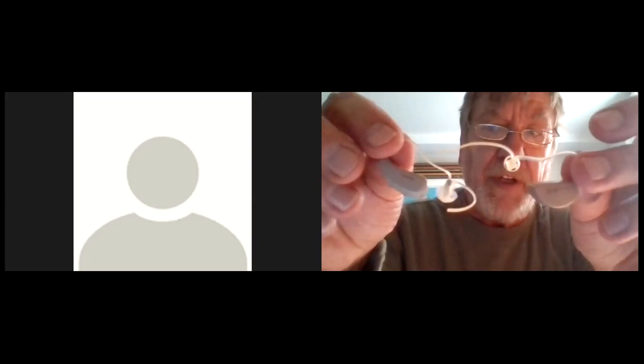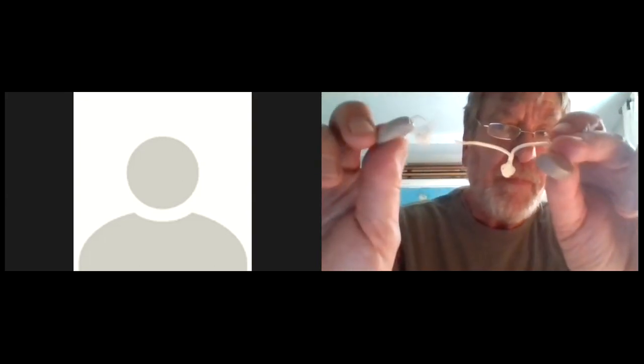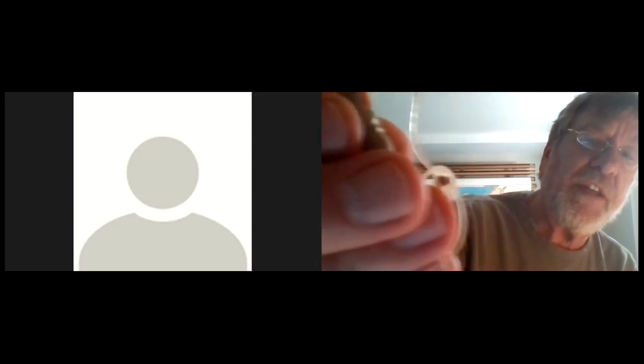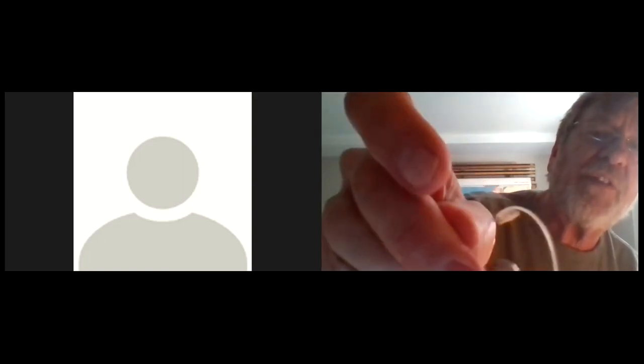Be sure, class of OTC, look at these two hearing aids. Quite similar. Both of them open fit. Turn this guy so you can see they're both open fit hearing aids. This one's a RIC because it's got a wire running through the tube, and the receiver is in the canal. That's the receiver, and of course the dome on the receiver.